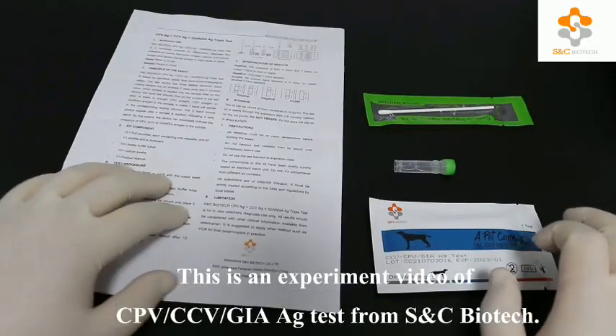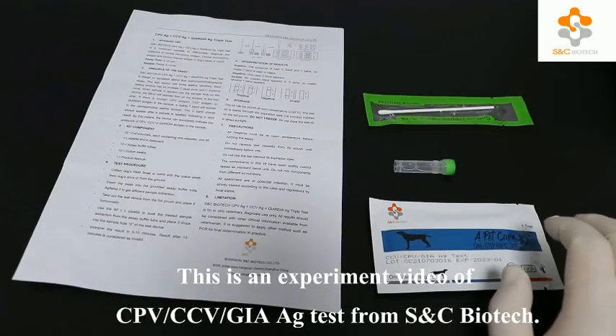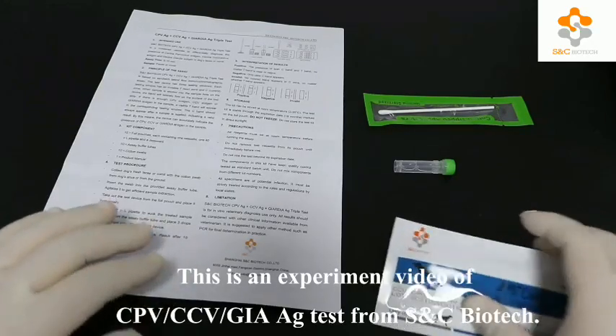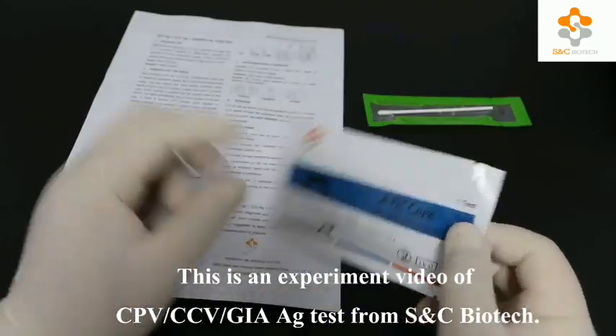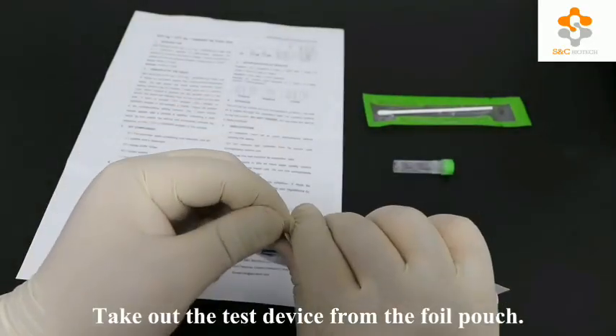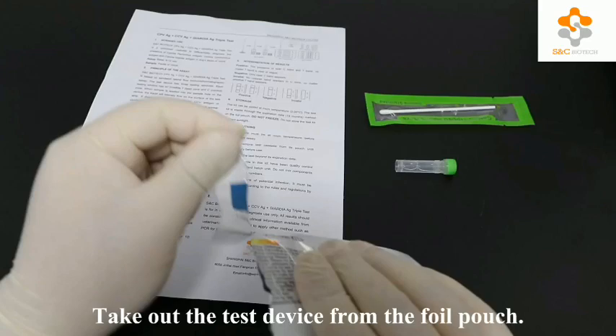This is an experiment video of canine parvovirus, canine coronavirus, and Giardia antigen test from SNC Biotech. Take out the test device from the foil pouch.